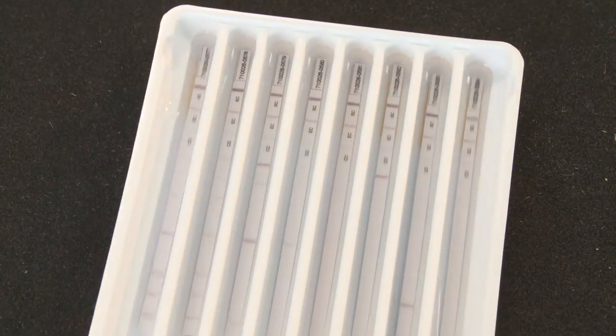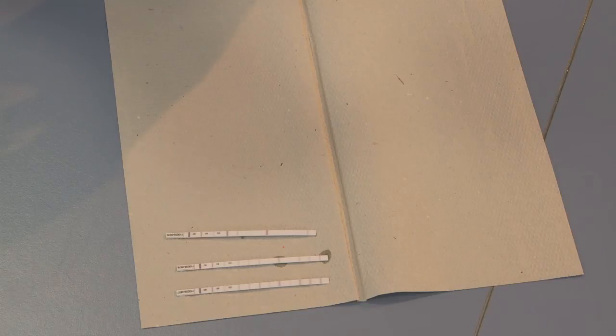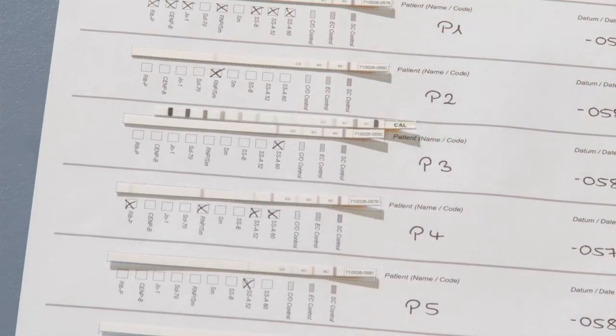Before evaluation, the immunoblot strips must be laid out on absorptive paper to dry. The dried test strips are attached to the documentation sheet and can be analysed by comparing the colour intensity of a band on the test strip with those on the calibration strip.